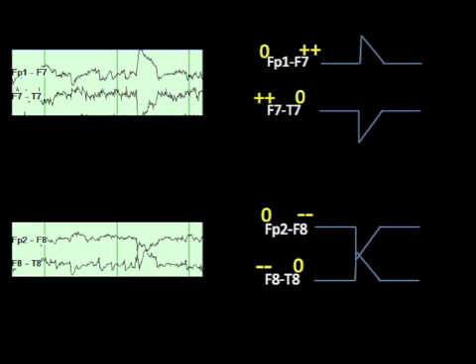One useful shortcut to determining the direction of horizontal eye movements is to look carefully at the deflection of the baseline in the two most anterior temporal leads on one side and the other. In this case, with our leftward eye movement, the deflections are such that they move away from each other, creating a space in between the first two channels. We could imagine that we could fit an eyeball in this space. When you look at horizontal eye movements in the future, if you can fit an eyeball in the space between the first two channels in the temporal chains, then the eye movement is likely in that direction.